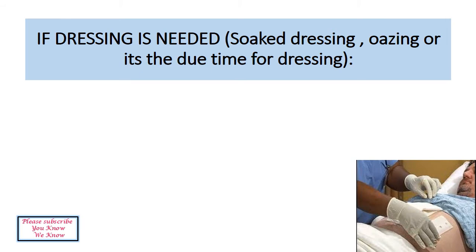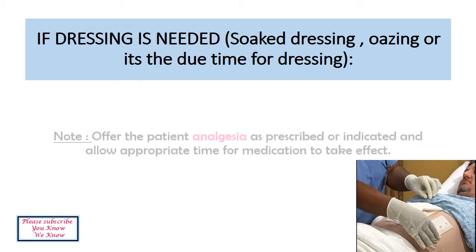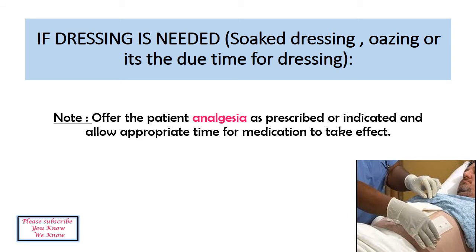If a dressing is needed, such as for a soaked dressing, oozing at the site of the drain, or it's due time for the dressing, then always remember to offer the patient analgesia as prescribed or indicated and allow appropriate time for the medication to take effect, because the drain site will be very sensitive to pain.